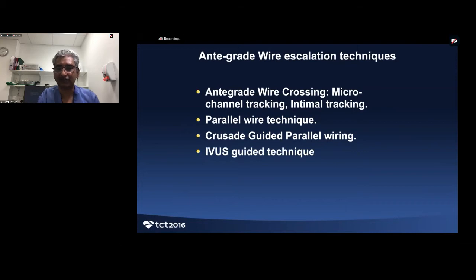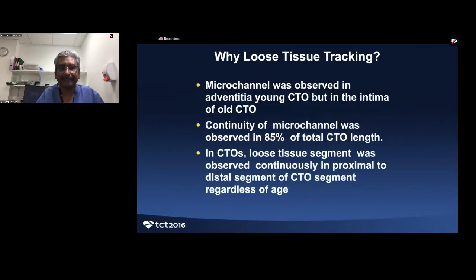A little bit of modification of this is a microcatheter-guided parallel wire technique, or a double lumen catheter-guided parallel wire technique. The IVUS-guided technique also comes into play to facilitate your antegrade wiring of the CTO. Now, why do you choose loose tissue tracking?